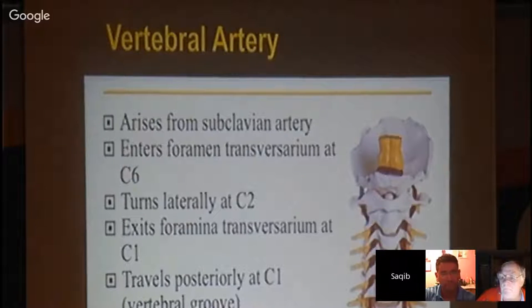It's good. Vertebral artery, obviously, course, it was shown very nicely twice yesterday. So I don't need to really go through it. Somebody asked me about what goes through the C7 foramen. Only vein. Okay, vertebral vein in about 95% of patients, and 5% nothing goes through it. But generally speaking, our concern when we are putting in screws is where exactly the vertebral artery is going.